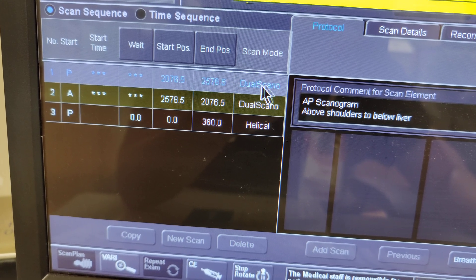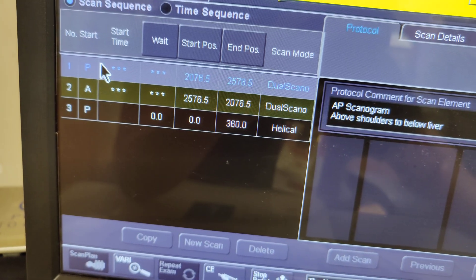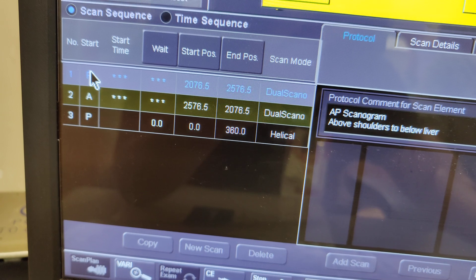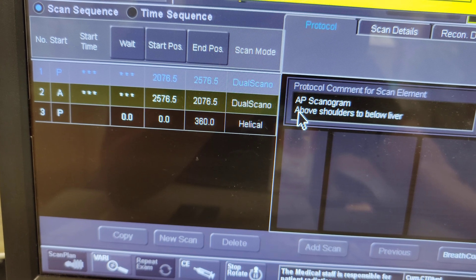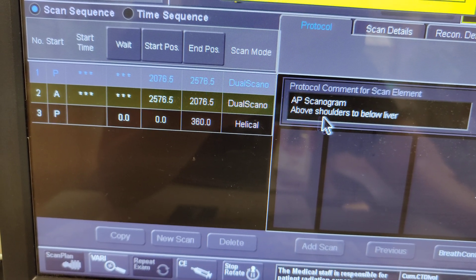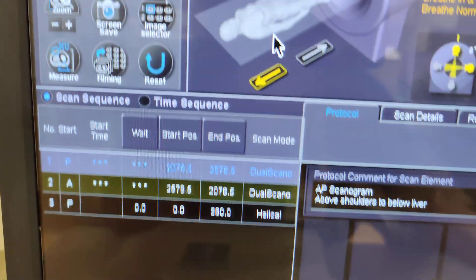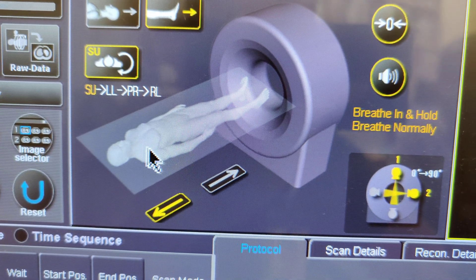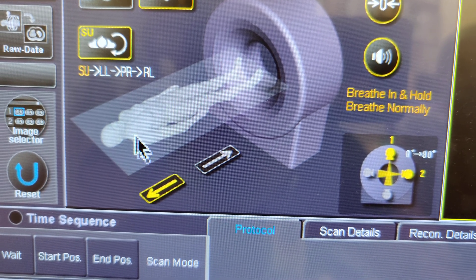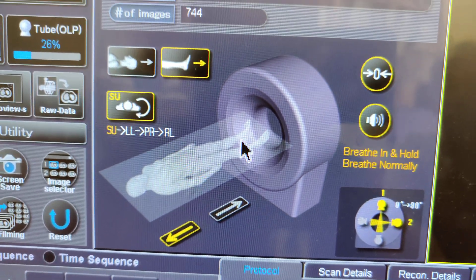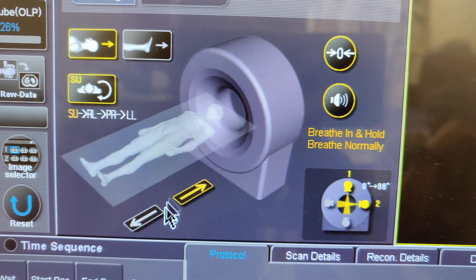So if you're just scanning a chest, it's going to show an AP view of the chest. The second one is your lateral view. The scan is AP — above shoulders to below liver — and you're going to set your lights to above the shoulder, then it'll scan the patient. There's a diagram showing the patient coming out, so just make sure you're going in the right direction.